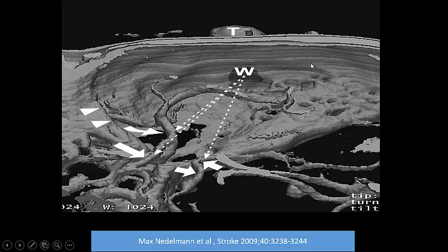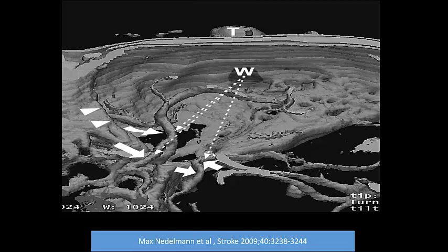Looking at this CT reconstruction image, you place the probe here in the temporal approach, in front of the tragus. Here is anterior, here is posterior. The ultrasound beam will get the middle cerebral artery at a good angle. If you tilt the probe downward, you will get the posterior cerebral artery at the lower level. The most important thing is placing the phased array probe in front of the tragus with 30 degrees from the horizontal.